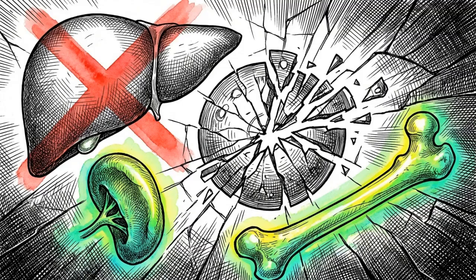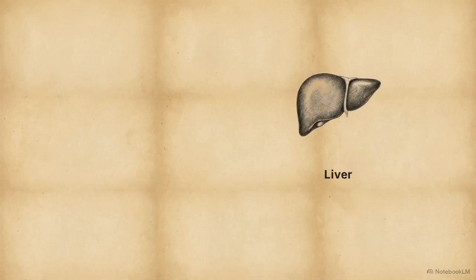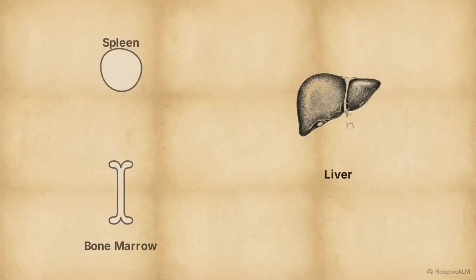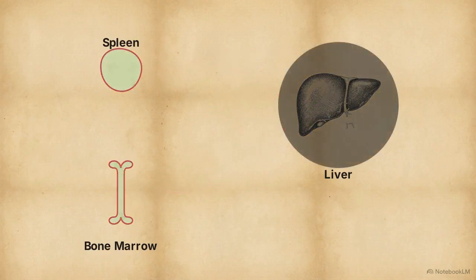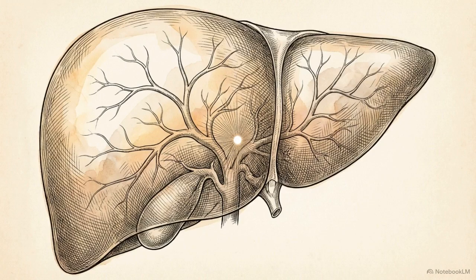We can also see a breakdown in this process known as colloid shift. When a diseased liver, such as in severe cirrhosis, physically fails to eat the perfectly sized particles, the portal hypertension redirects the tracer, forcing the spleen and bone marrow to absorb them instead. The macroscopic visualization of a human organ depends entirely on engineering physical particles down to the fraction of a micrometer.